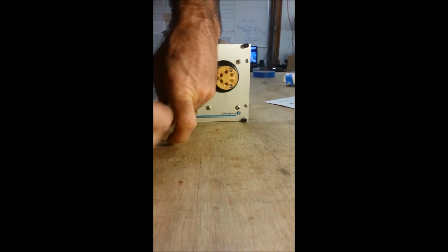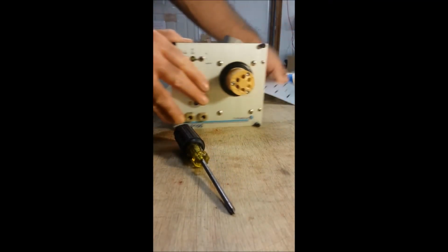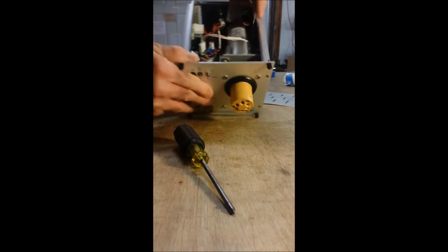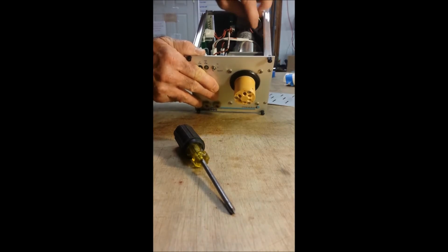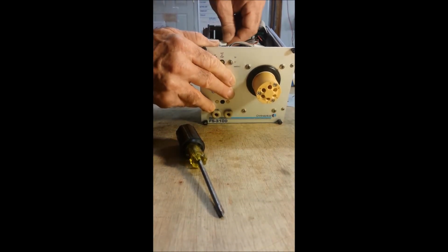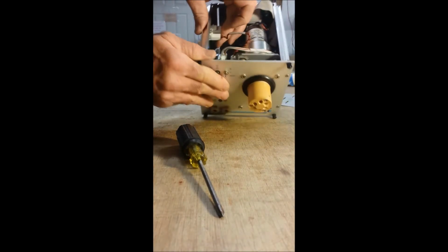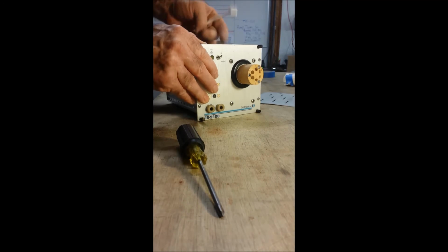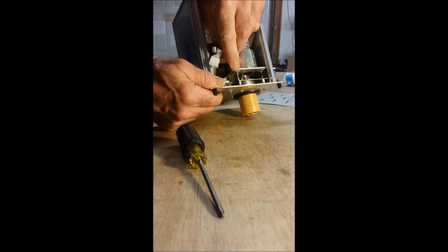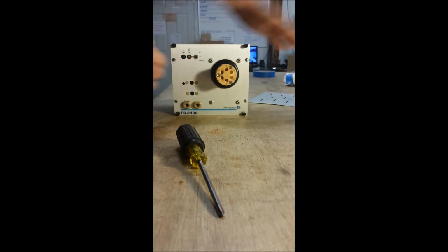Making sure it's all nice and buttoned up. The bottom plate will hold everything together. Like I said, the top plate isn't super necessary. You feed this cable down on the side, and then the last thing you want to do is hook up the power module and the front sensor, and they only go one way, and you're good to go.